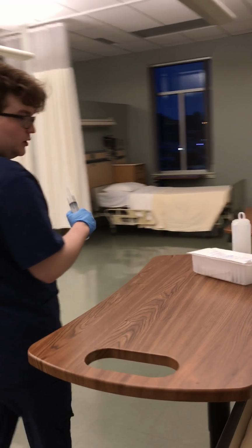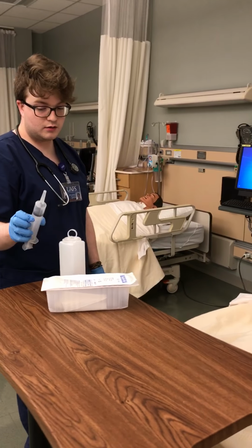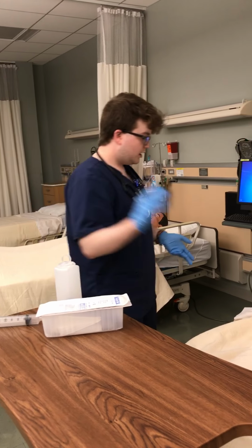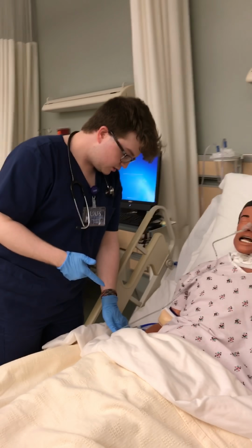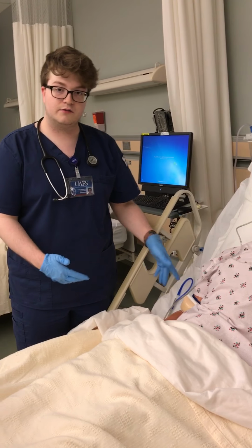Knock, knock. Hello. My name's Aaron. I'm a student nurse. I got an order to give you a medication of acetaminophen through your NG tube. Is that okay? I would want to make sure that it's the right patient, right medication, and make sure that this is unhooked from suctioning.